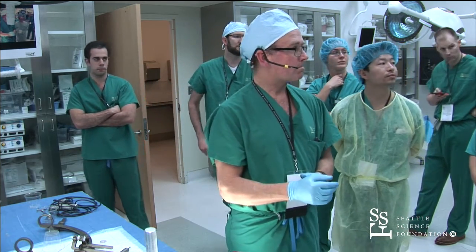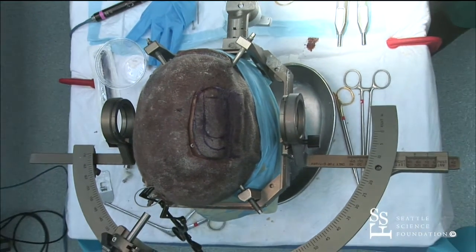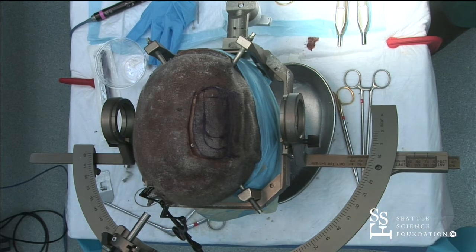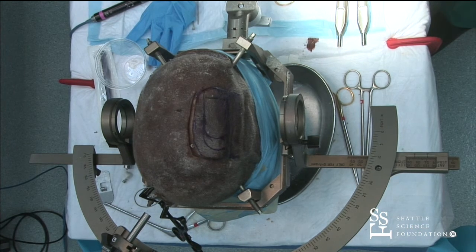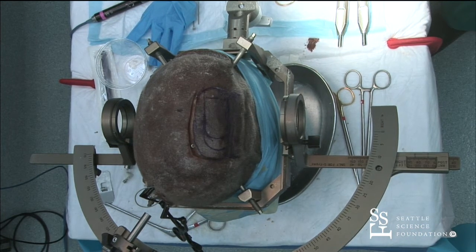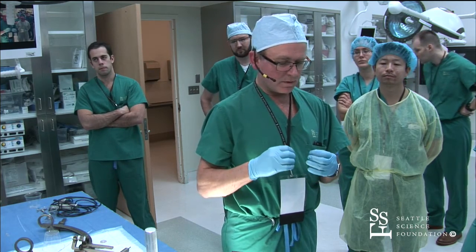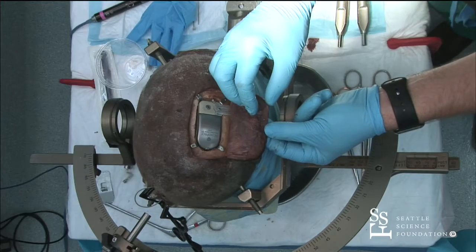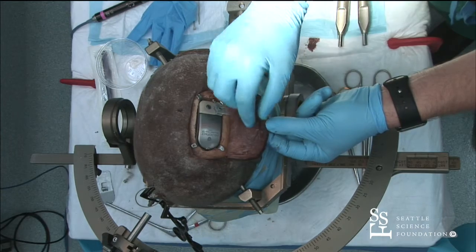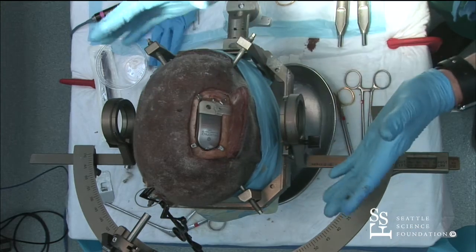How do you close the skin, and what do you tell them for wound care? Oh yeah, great. Everybody's different on how they like to close. I personally think that infections are a big risk for these patients, and you are coming back oftentimes. I have one patient that I've had to go back in 6 times. So having a really good closure that's not going to end up with really thin skin is very important. And I believe that making sure it stays a 2-layer closure is the best thing. Making sure that the galea is available on both sides to bring together is very important.